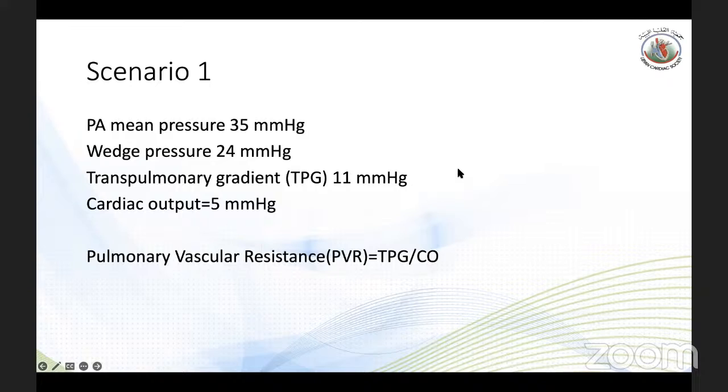Also, as common sense, you need to be under complete sterilization to avoid infection, because you are going into the heart. You might induce infective endocarditis if you are not careful. If the patient has coagulopathy, especially severe thrombocytopenia, you need to be careful too.